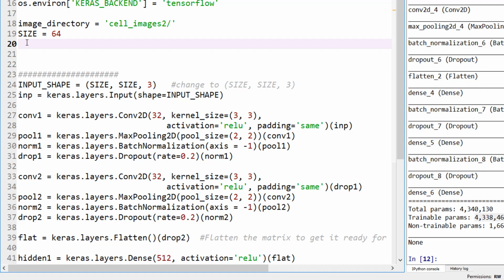So now we will be reading in images, which is again nothing but a numpy array. You can store them in a list of numpy arrays. You can create an empty list and populate it with all the numpy arrays, each numpy array corresponding to an image that we are reading. Or you can create a pandas data frame to hold all your data. It's up to you how you want to handle it.